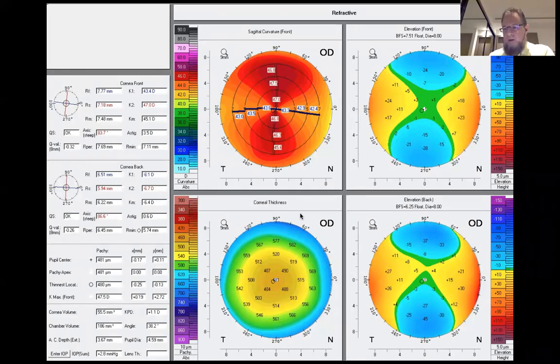In addition, it should not end up with a cornea less than 400 microns. So as long as the thickness allows me to end up with more than 400 microns, I treat. But I do not exceed -8 spherical equivalent. I don't treat, for example, -10, even if the cornea is 600.